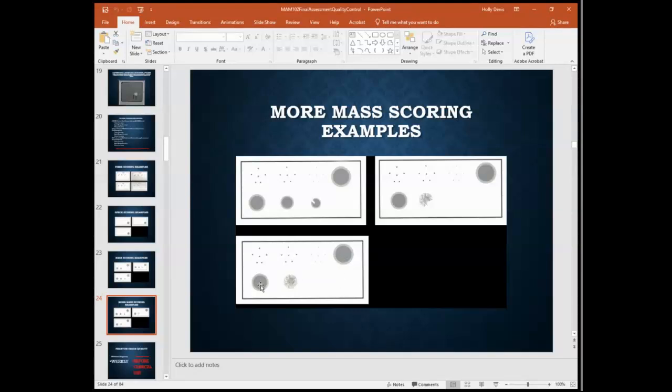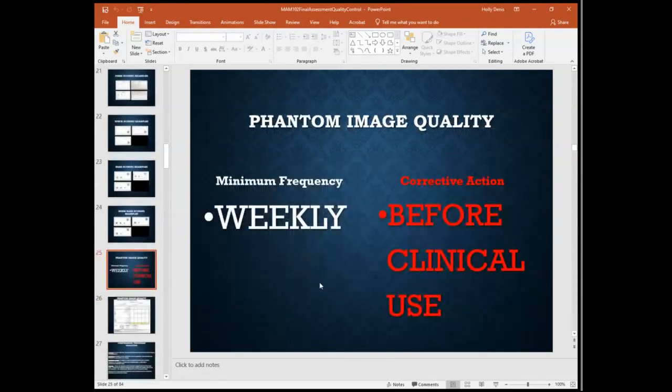Moving on to this last one, I do see 1, 2, 3, because that looks generally circular, and it looks like it's almost in a full shape. So just as long as you have some sort of background density difference, and I am seeing a density difference, which makes this look like I can visualize a full circle here, even though there's some wider areas. It's still right. It's not as full, or not as dark. All right, so moving on.